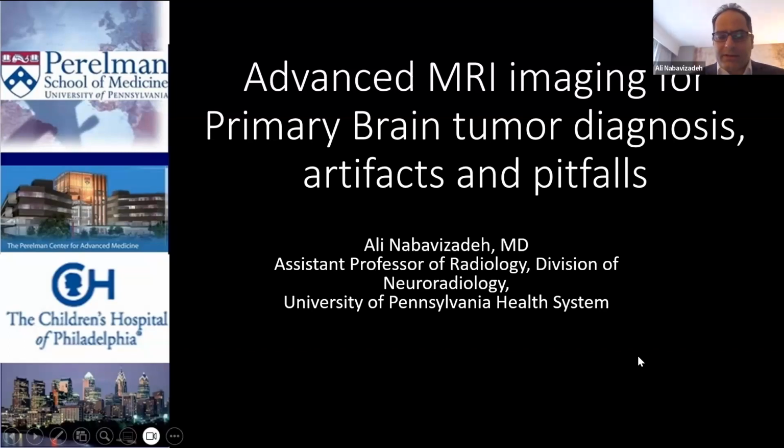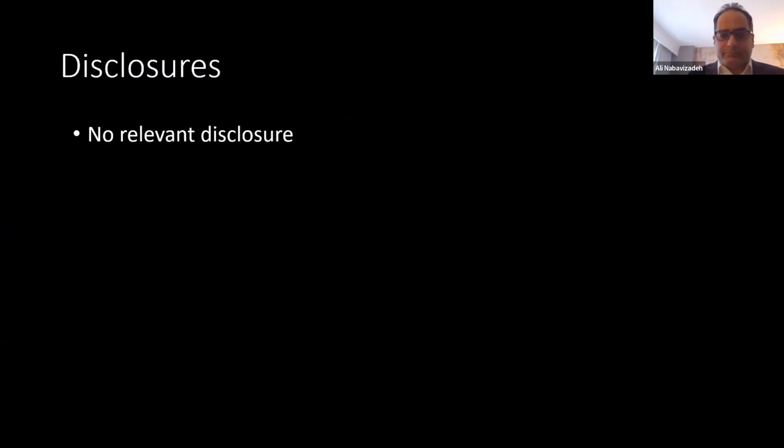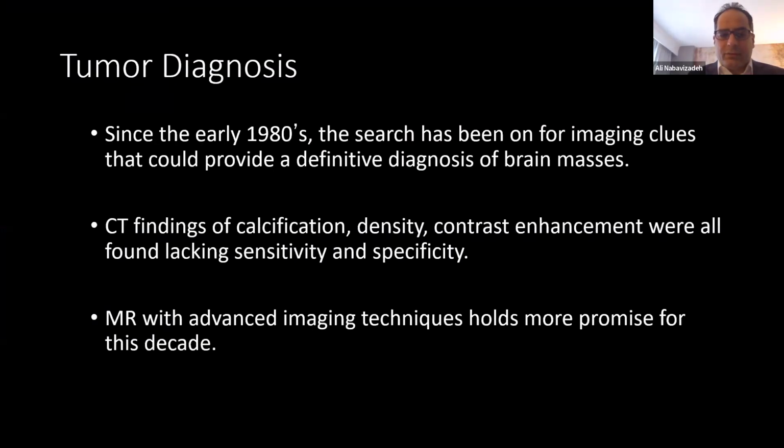All right, good morning, everyone. I'm going to be speaking about advanced MR imaging for primary brain tumor diagnosis, focusing also on artifacts and pitfalls, which are very important. I don't have any relevant disclosures.